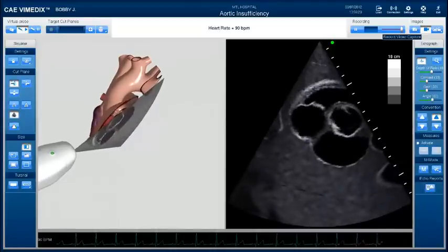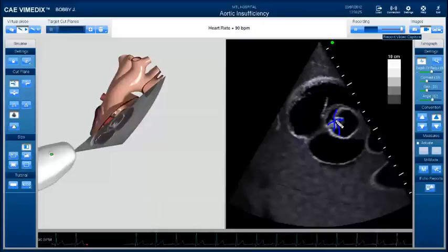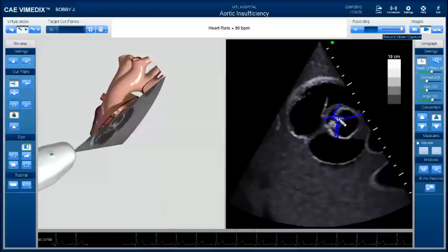Here we go. You'll pan back through it again and you'll see that the valve itself never quite fully closes, and that's the problem. You should see this be closed there — those are the three leaflets of the valve right there. And here, at their tightest point, they're not quite closed. This would be one leaflet, this would be the other, and this should be the third. There's still a little gap right there in the middle, and that's a bad thing.